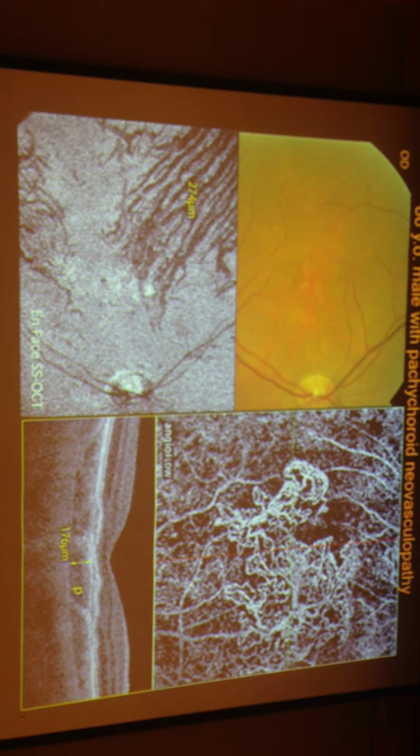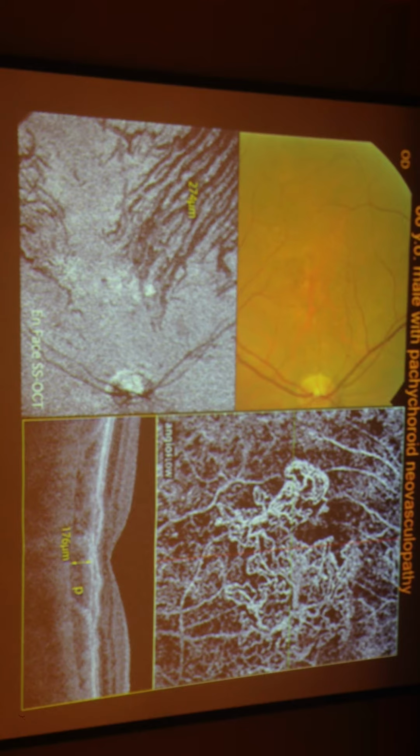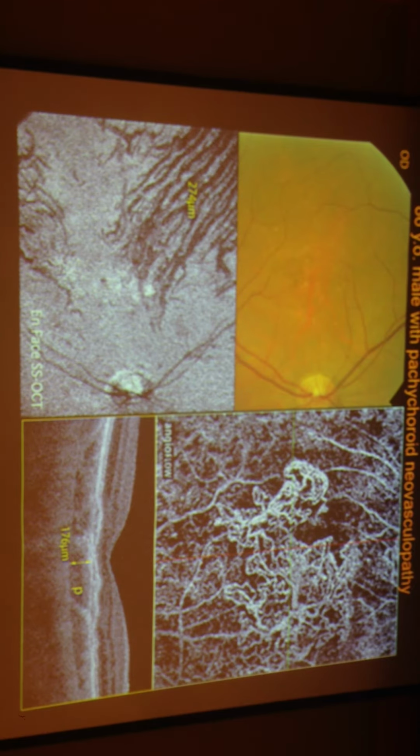Have you had the opportunity to treat any of these patients whom you identified to have an abnormal vasculature but did not have subretinal fluid? If the patient has a type 1 neovascularization membrane but no subretinal fluid, usually, if the vision is still good, we don't treat those patients. So what percentage of patients will progress to have subretinal fluid and defect? Something like this we can see at an early stage, and we know for sure that it's going to progress and eventually drop the vision.